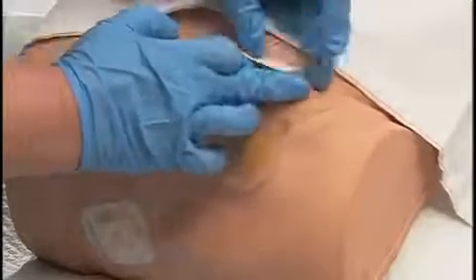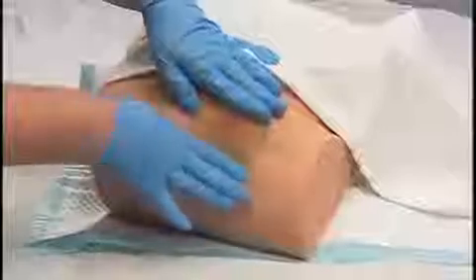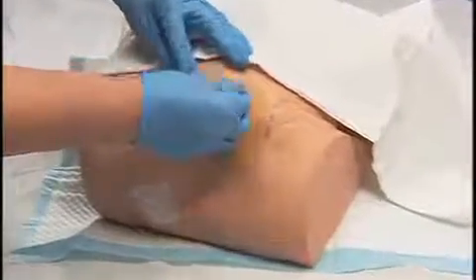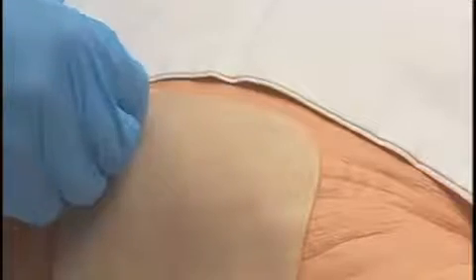You may apply tape around the edges to secure the dressing. Dispose of waste, remove gloves, and discard. A hydrocolloid should be changed if it is leaking, falling off, or has been on the wound for seven days.